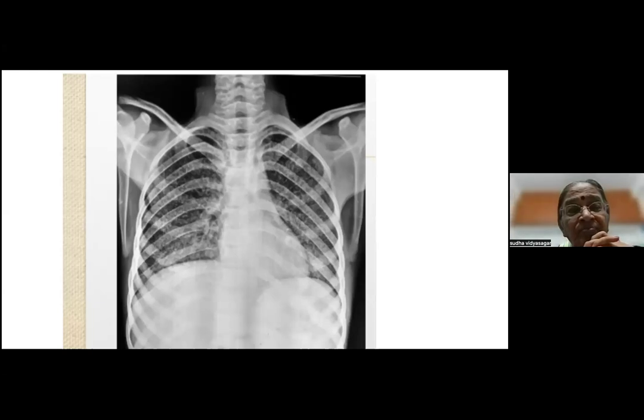Somebody is calling it silicosis. Okay. Pulmonary alveolar microlithiasis. Okay. What happened to tropical pulmonary eosinophilia? Histoplasmosis. Okay. There are so many conditions which can present with miliary mottling, right? Lymphangitis carcinomatosis. So many are there.